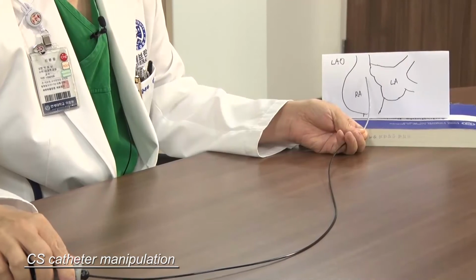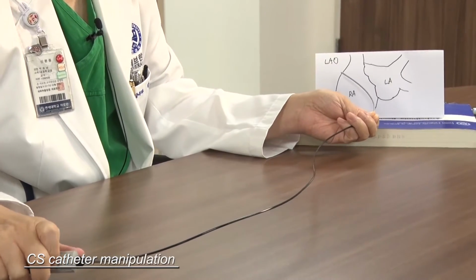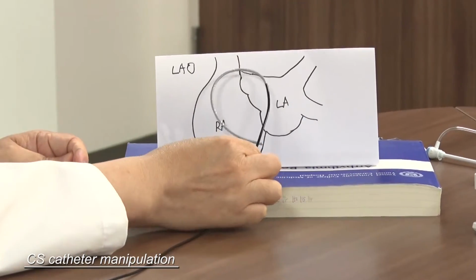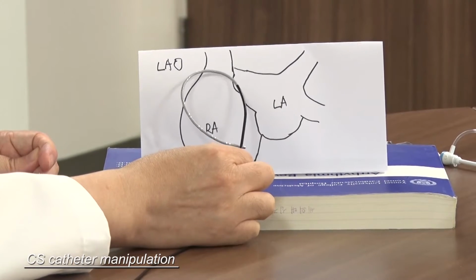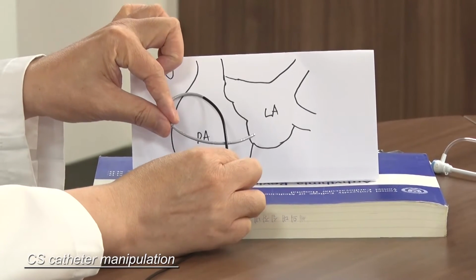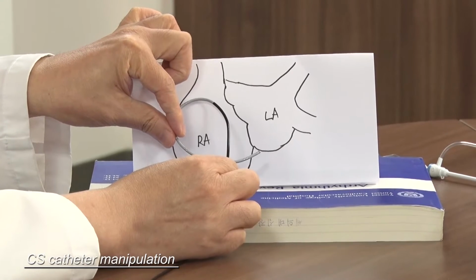So I would like to give you my tip. First of all, you can move the catheter to the right atrium first, and then try to make a curve, make a full curve, and push in, push in, push in. So make this position, like this position. But depending on the catheter tip position, sometimes you can luckily engage the coronary sinus, but sometimes not.